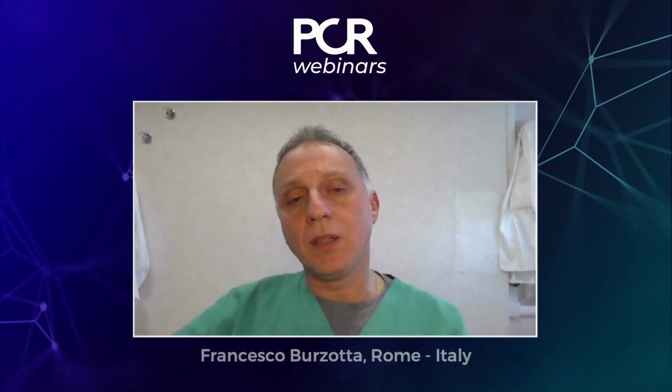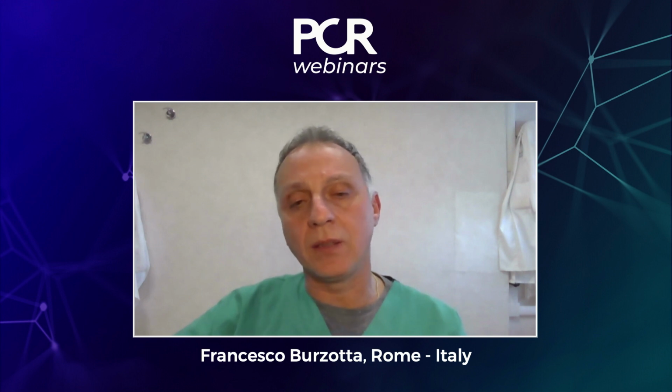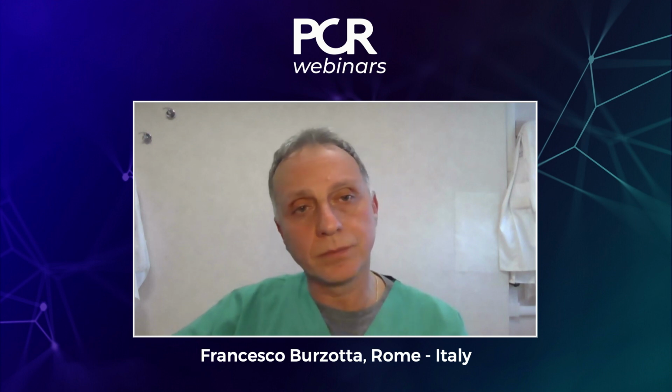Yeah, for sure. I think that with really good reasons we promote use of imaging, but Igor is asking, would you do the inverted provisional in this case if you don't have IVUS or OCT? So is imaging mandatory if you want to do the crossover inverted fashion? Honestly, I think that it is really something that improves the flow of your procedure and helps you in accepting the result at the end. However, sometimes I did it in the past without imaging.